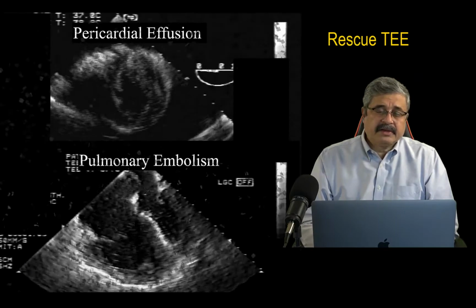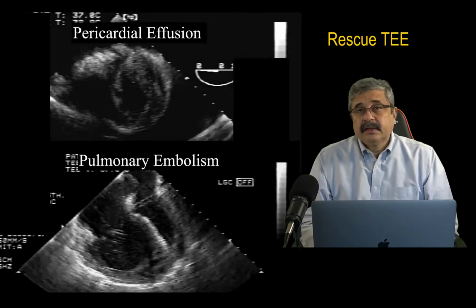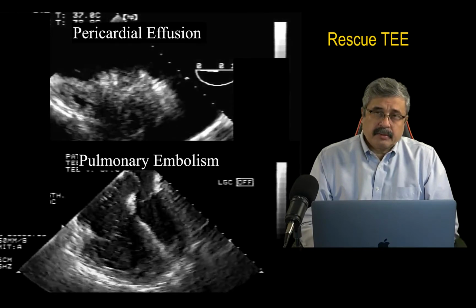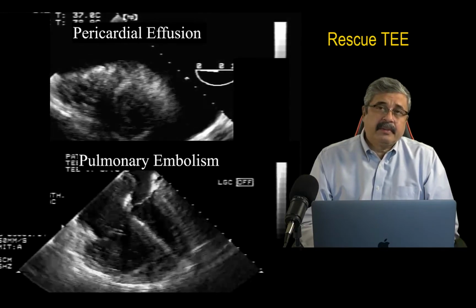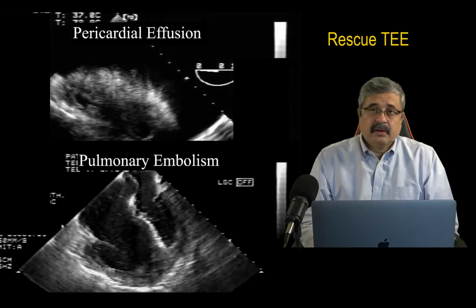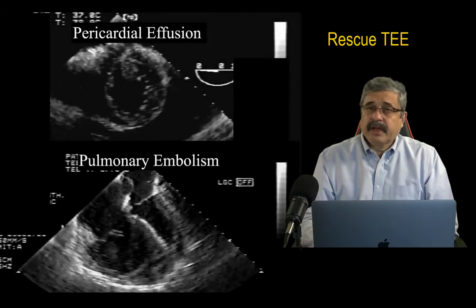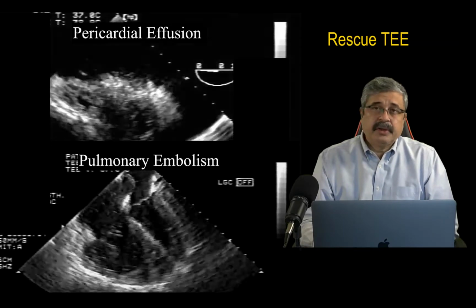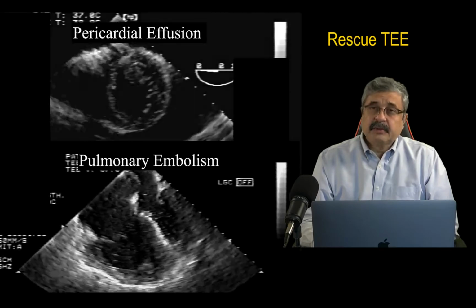This patient above has a massive pericardial effusion and pericardial tamponade and needs that drained emergently, either in the cath lab or the operating room. Whereas the patient at the bottom has a classic sign of pulmonary embolism that consists of a dilated and hypokinetic right ventricle with a hyperdynamic left ventricle. The response from the team should be to give the patient epinephrine, heparin, and continue with the CPR.